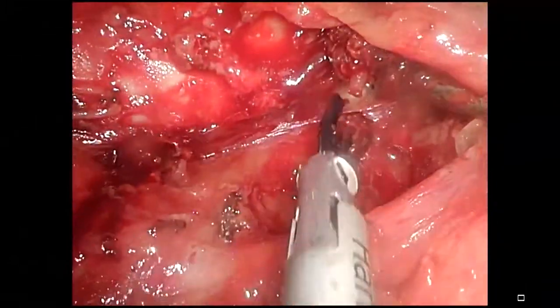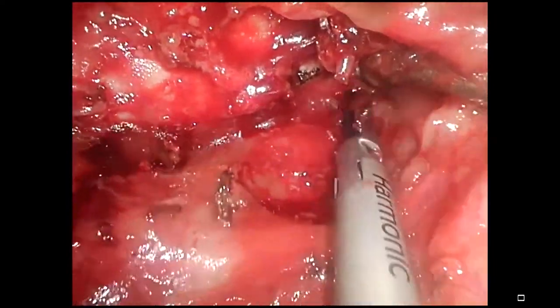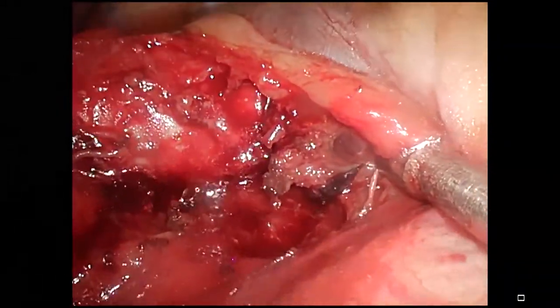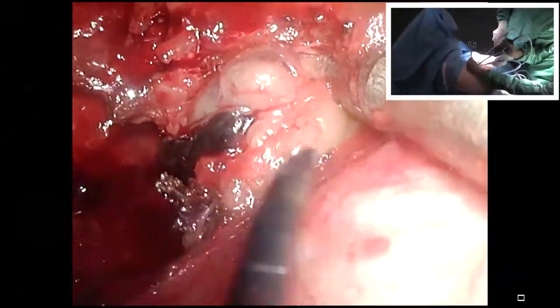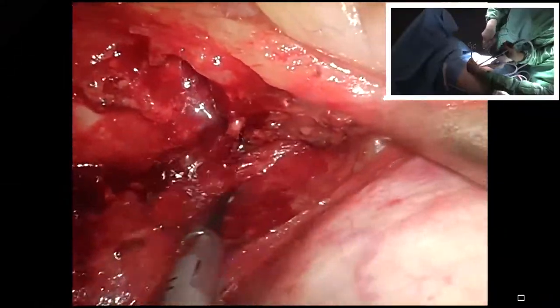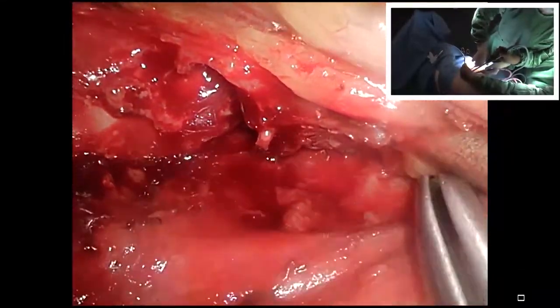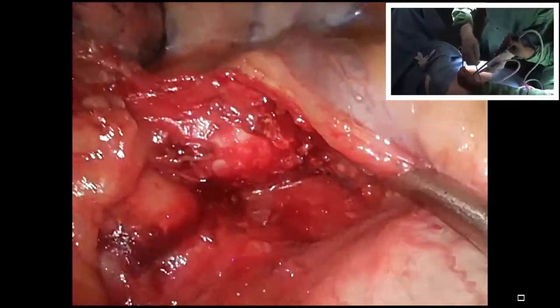This is what we call advanced instrumentation. Give us again the small picture from the outside to see the instrumentation. Thank you. That's fine. So we can see that. You don't suffer with dissection. This is a very nice trick to go across the cable. But maybe we don't need to do more. It's okay. Go out.